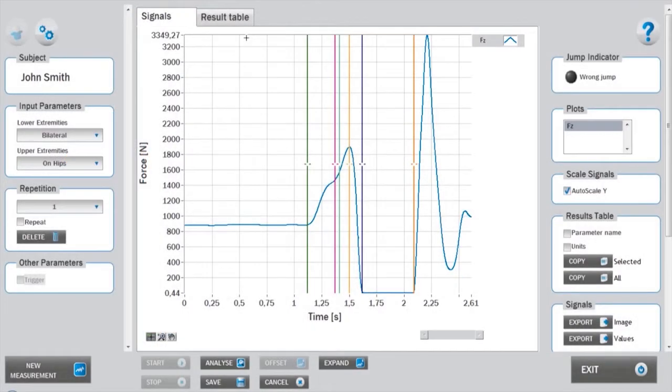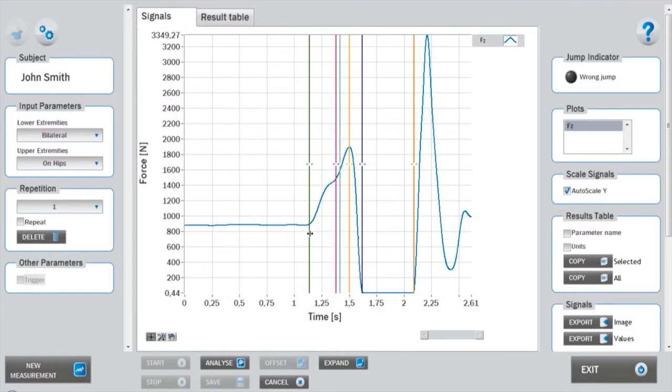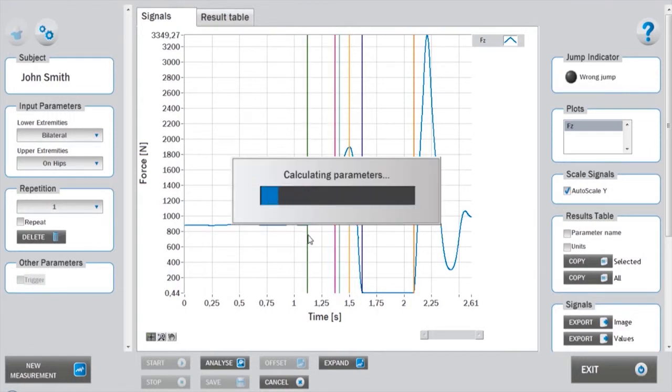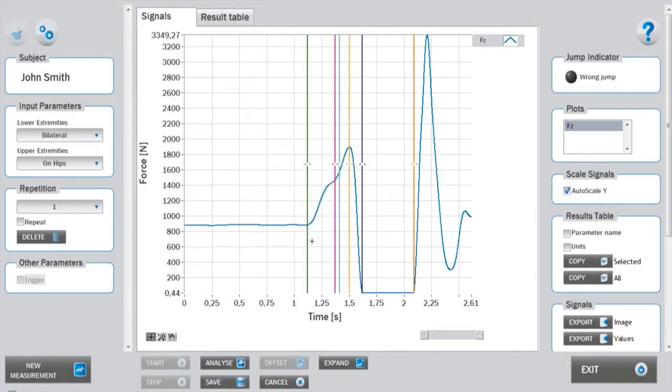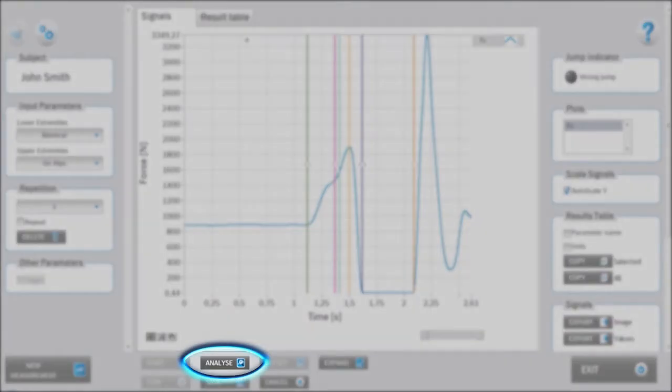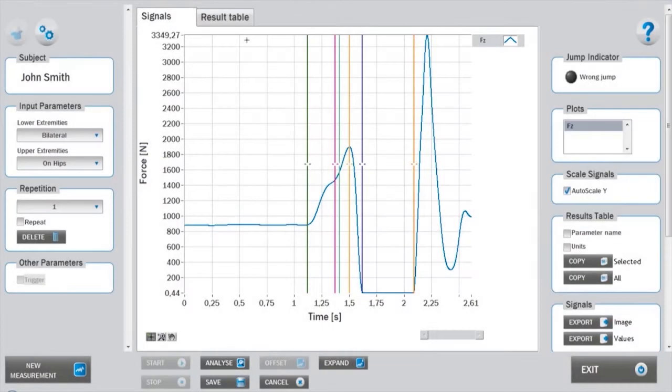The cursors positioned on start, takeoff, and landing can be manually adjusted. Other cursors are adjusted automatically. If again automatic positioning is required, click analyze and the cursors will be repositioned according to your settings specifications.